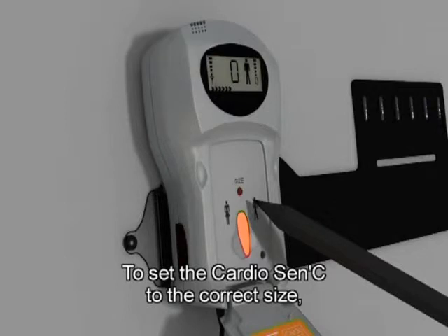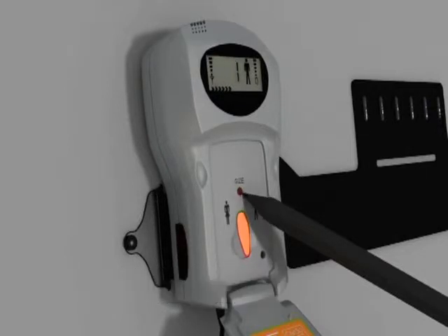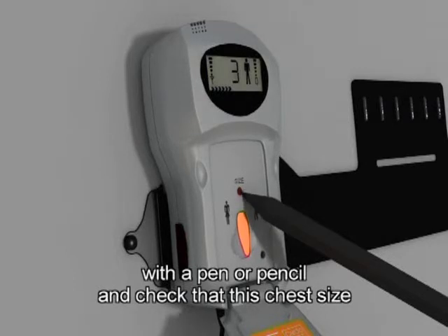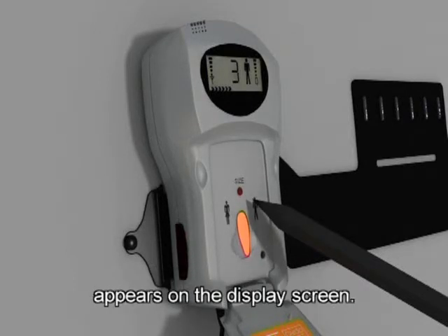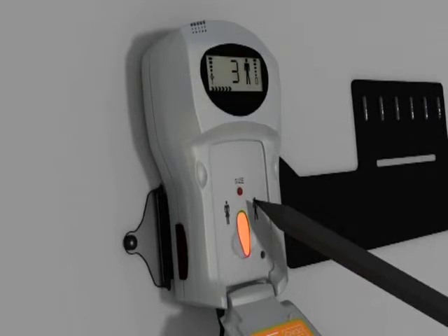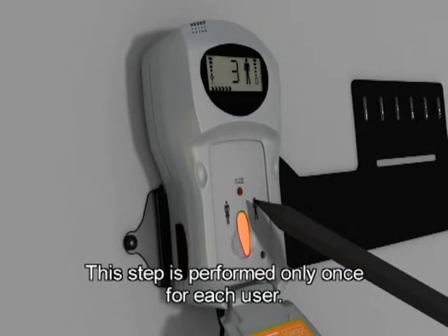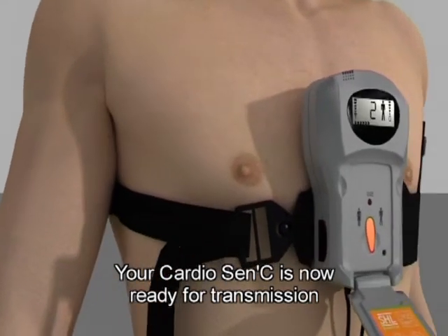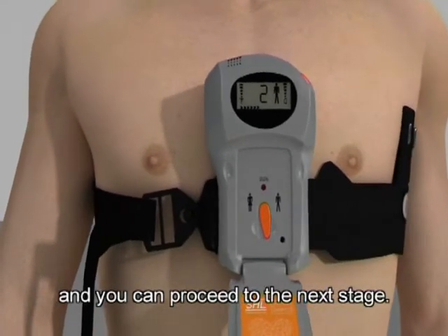To set the CardioSen'C to the correct size, press the size selection button lightly with a pen or pencil, and check that this chest size appears on the display screen. This step is performed only once for each user. Your CardioSen'C is now ready for transmission and you can proceed to the next stage.